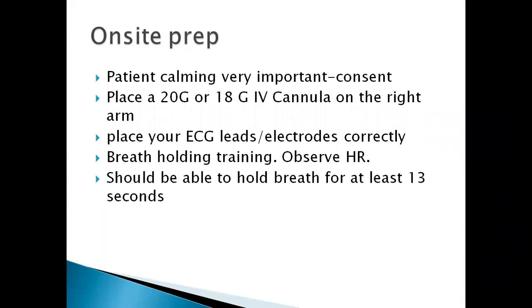Depending on your departmental protocol, this may be a nurse that will have to do this. But I know other departments where the radiographers are the ones that put the cannulas. And when you have put it in, put the patient on the bed and place your ECG leads, making sure that you place them correctly. Ask the patient again to hold their breath and then observe the heart rate on your ECG monitor.